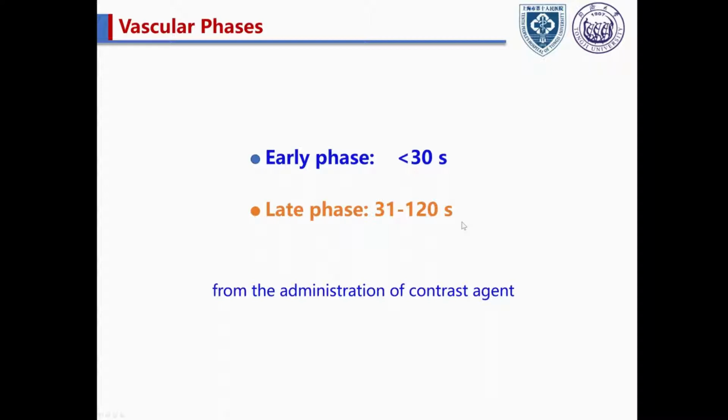So, how to diagnose these breast lesions? So this is the CEUS patterns for benign breast lesions.